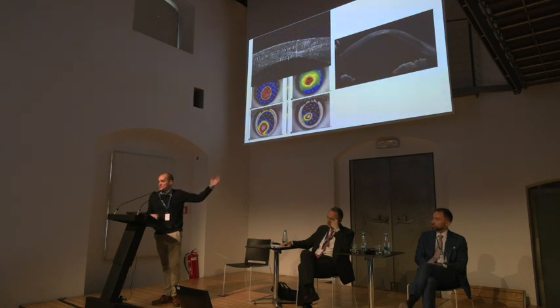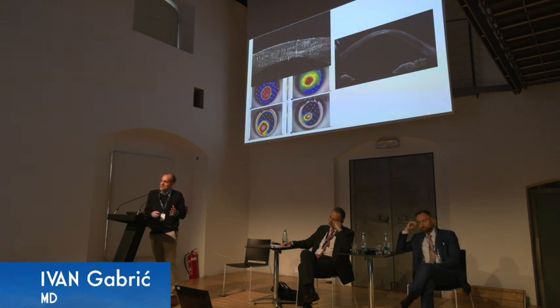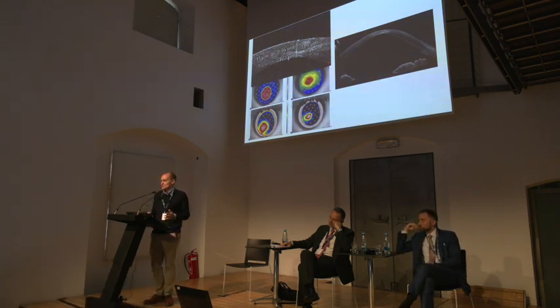This is what we used to trust when making decisions in corneal refractive surgery, keratoconus, or refractive surgery. I don't understand how everyone today is not ditching their Scheimpflugs and saying, I don't want it anymore. Because the level of lies that you get from a machine and the level of confidence it gives you is impossible.